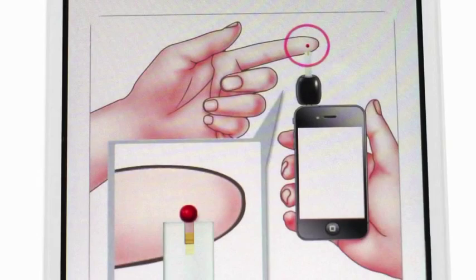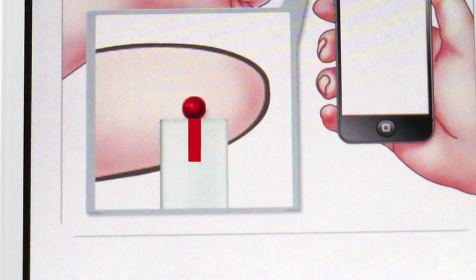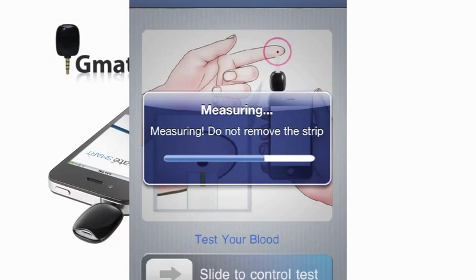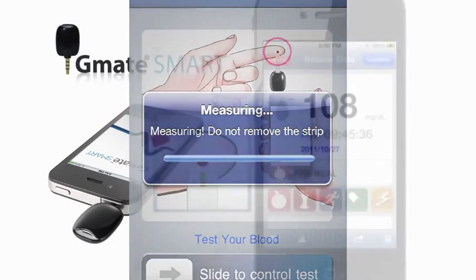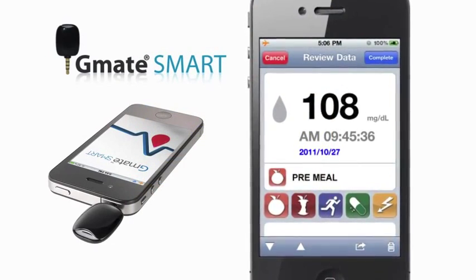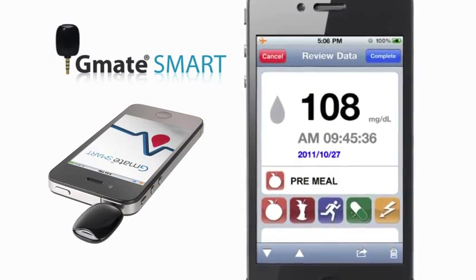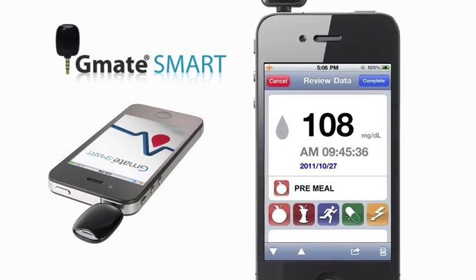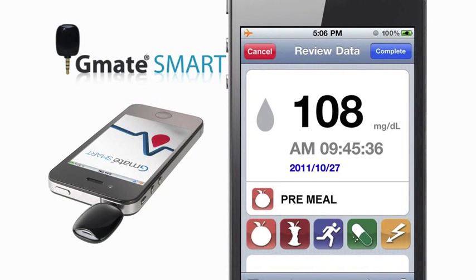Bring the tip of the strip to lightly touch the drop of blood. The application will show a countdown within 5 seconds. Your blood glucose test result is shown on the display screen and automatically stored in your smartphone. You can add a note to a test result by selecting an icon.